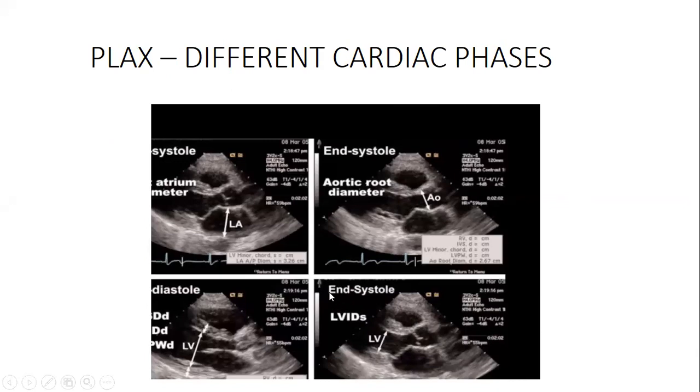Look at this. This is end systole. It simply means the heart at this stage has completely contracted. When the heart has completely contracted, the muscles are thick.